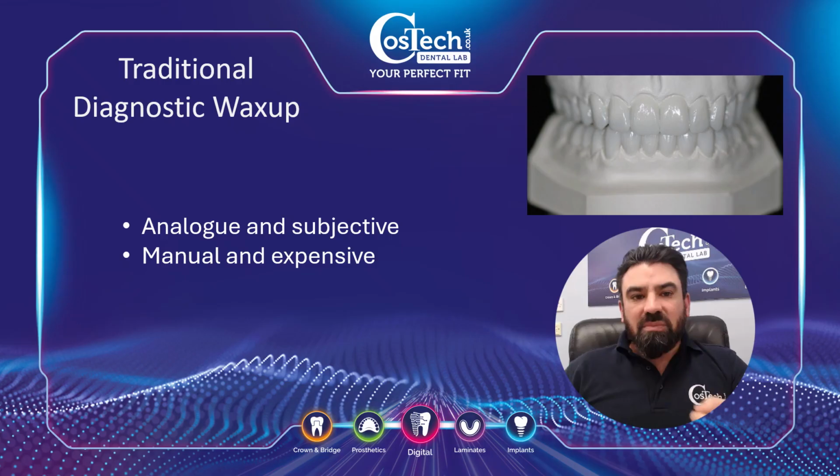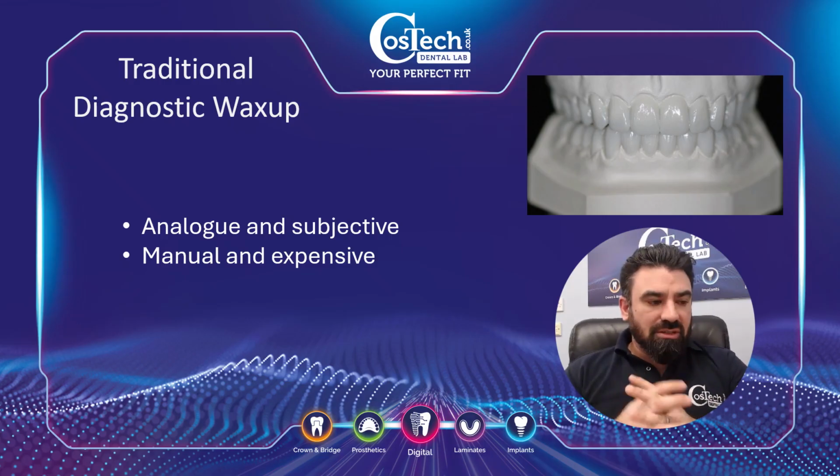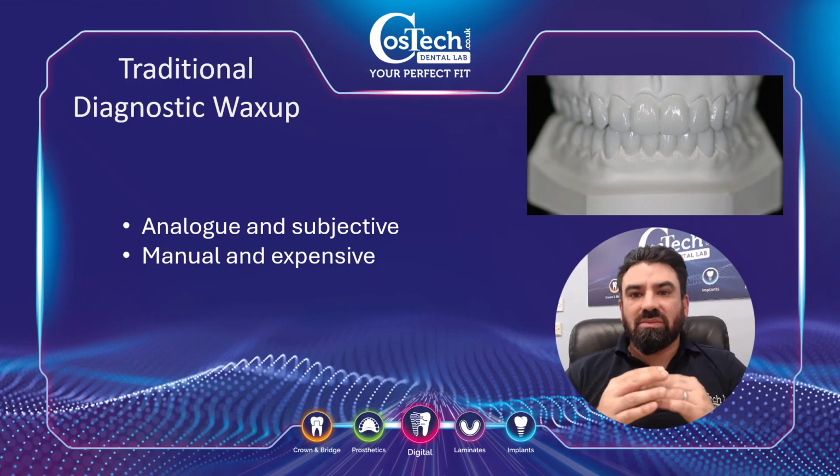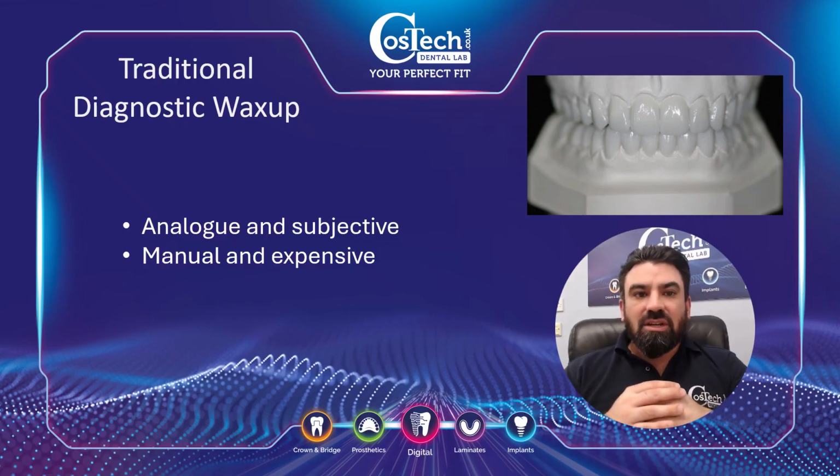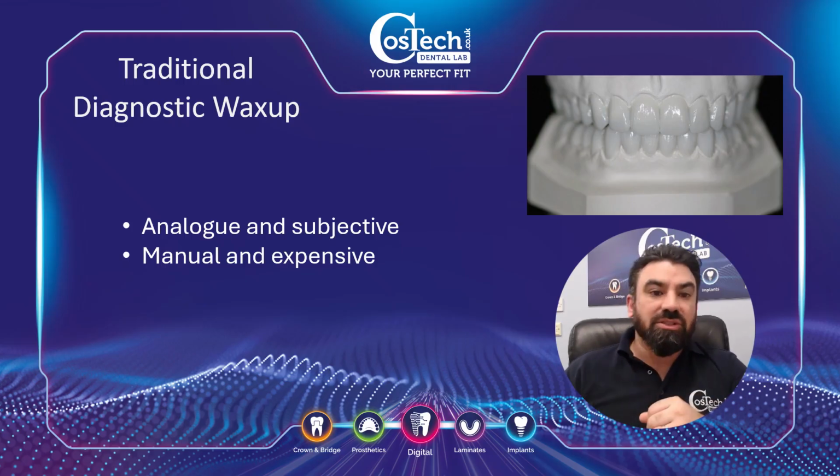It became a very manual and expensive process. A technician at the bench doesn't make anything on diagnostic wax-ups because of the amount of time they're spending. They'd rather be building up crowns. So we thought, well, why are we using the analog way when we have so many digital solutions at our disposal?